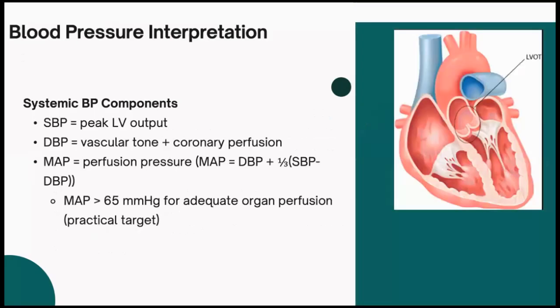And then if you look at the blood pressures, you can see the systolic blood pressure. The peak LV output is directly indicated by the systolic blood pressure. So if your systolic blood pressure is low, suspect whether the LV is contracting properly or not. As a bedside thing, nowadays you all have ultrasound in our facility most of the time. So use the echo probe, keep it at the LV, just go to the left side of the chest and have a look at the heart.